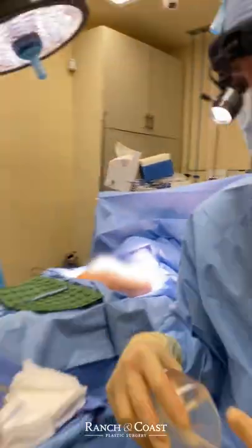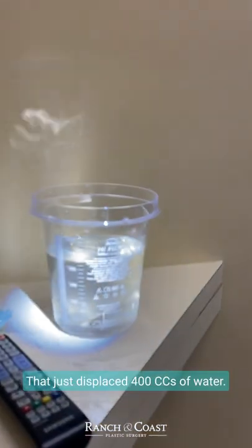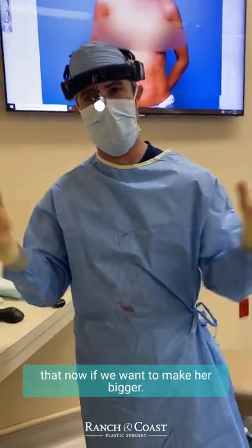We bring it over here and put it in this graduated cylinder — it's basically a bucket full of water — and we see how many cc's of water it displaces. That just displaced 400 cc's of water, so it's a 400 cc implant. We know we need to go a little bigger than that now if we want to make her bigger.